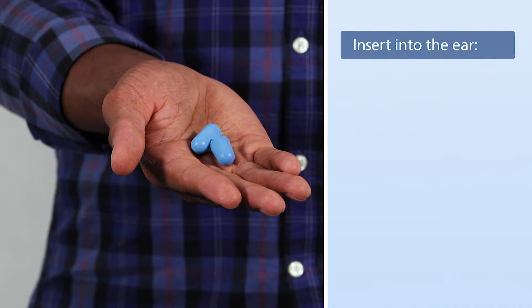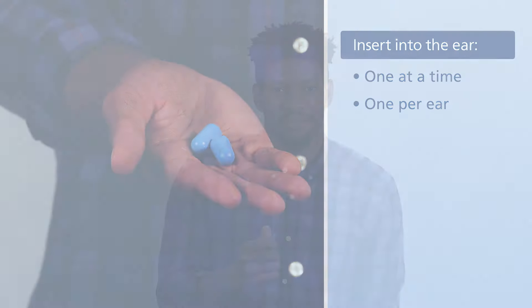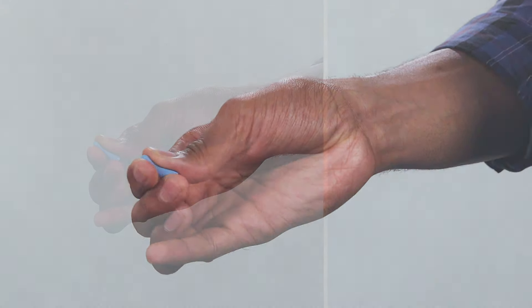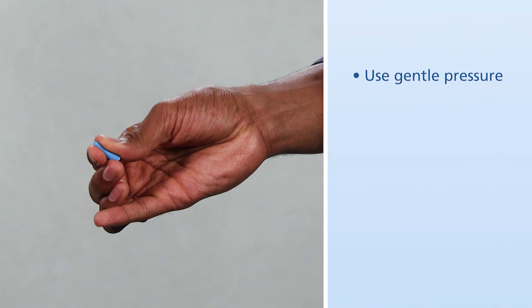For proper use, they will be inserted into the ear one at a time and one per ear. First, be sure your hands are clean. Then, roll the earplug up into a small, thin snake with your fingers. Use gentle pressure to roll the earplug, and then gradually increase pressure.